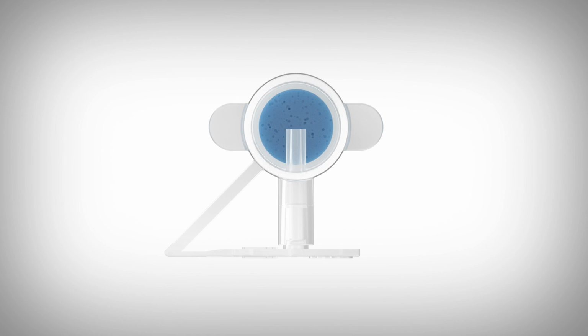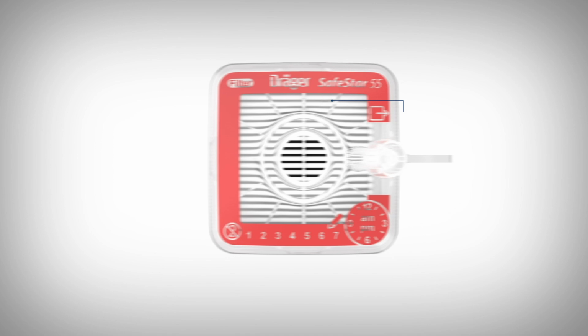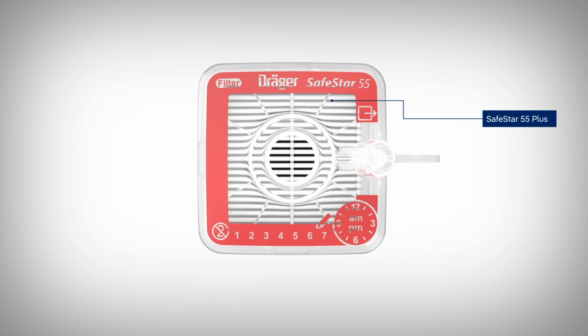For neonatal patients, the HumidStar 2 Plus is recommended. This is an HME and not a filter. Accordingly, a filter should be used on the expiratory and inspiratory ports of the device side. The SafeStar 55 Plus is recommended here.